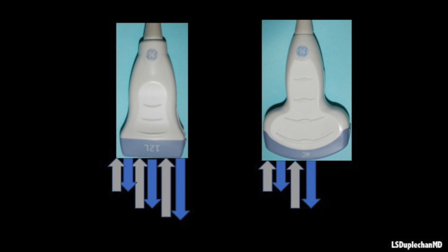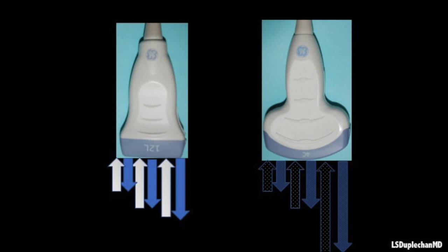The longer arrows noted at the curved transducer are to represent deeper penetration with a low frequency transducer. With all wave propagation and reflection accounted for, we will first focus on the high frequency transducer. The solid coloring of the returning arrows is to represent the excellent resolution with high frequency transducers. However, the shortened arrow length is to represent the reduced depth.